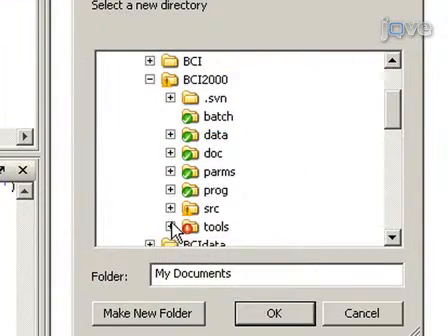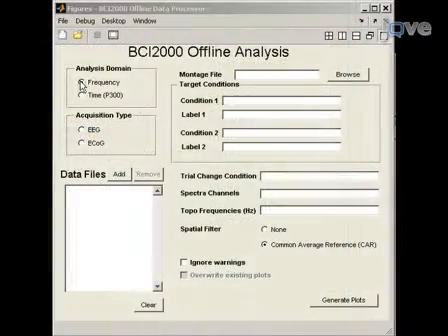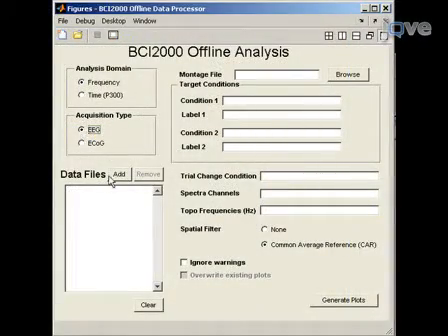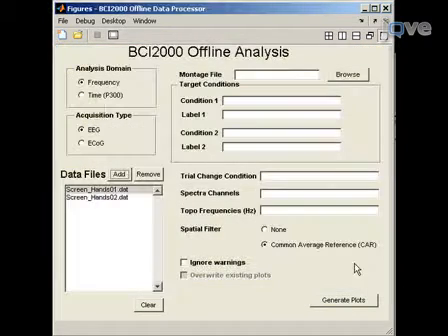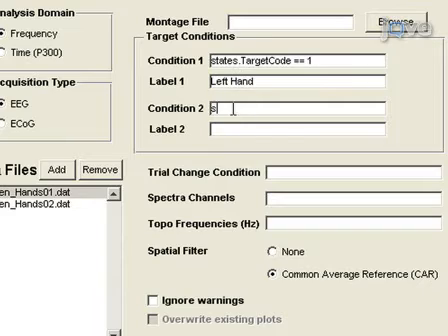Now that you have finished collecting the screening data, it's time to use the BCI 2000 offline analysis tool to determine which features in the EEG signal the users are able to voluntarily modulate. The offline analysis tool converts the EEG signal into the frequency domain where you can determine which channels and frequency features in the signal were maximally correlated with the tasks. Start the MATLAB program, navigate to the BCI 2000 offline analysis folder, and start the program. Use the program to determine which EEG features are strongly correlated with each movement. For each movement, plot the data, then find the plots with the largest R-squared values or strongest correlation. You can then use the channels and frequency bins with the largest R-squared values as control signals to move the cursor a particular direction.